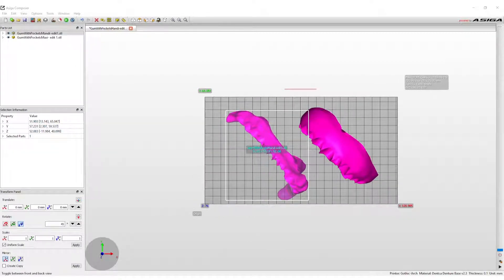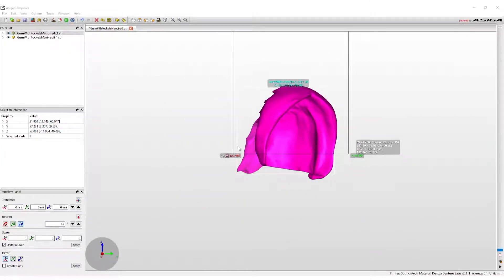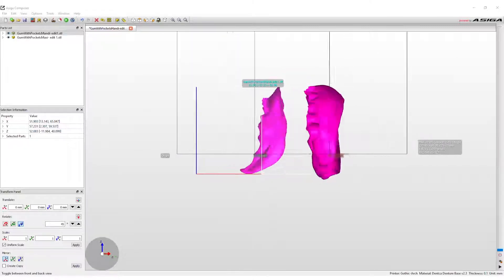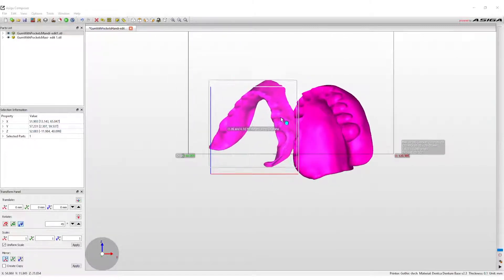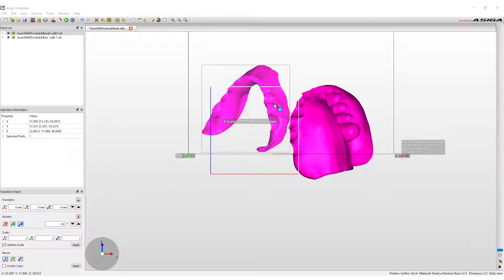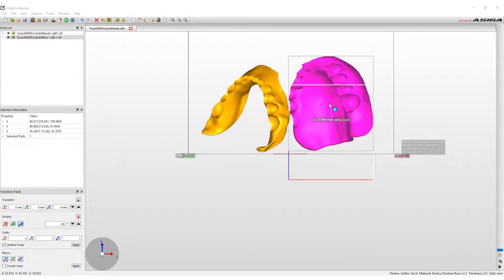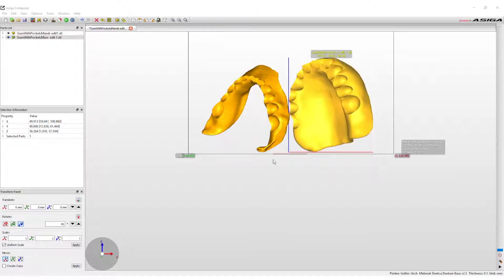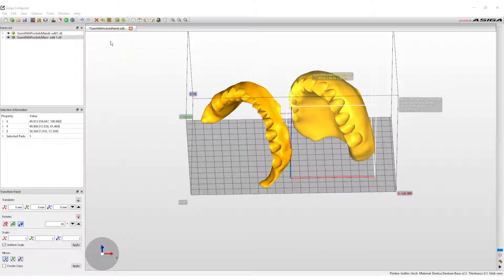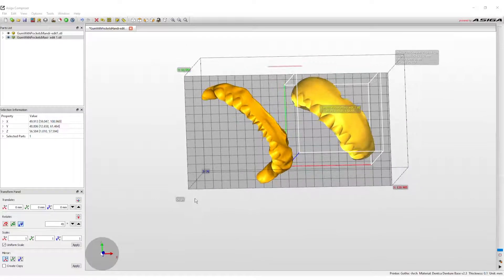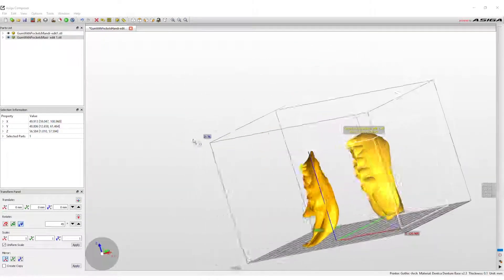View the print envelope from the top point of view to nest the designs within the horizontal space of the build envelope. Both denture designs may still appear purple, so use the different views to discover which part of the design is outside of the build envelope. Left-click and hold on the design and place it within the boundaries of the build envelope. When the design is within the limits, it will turn gold. Inspect from all sides to ensure proper placement of the denture base design.